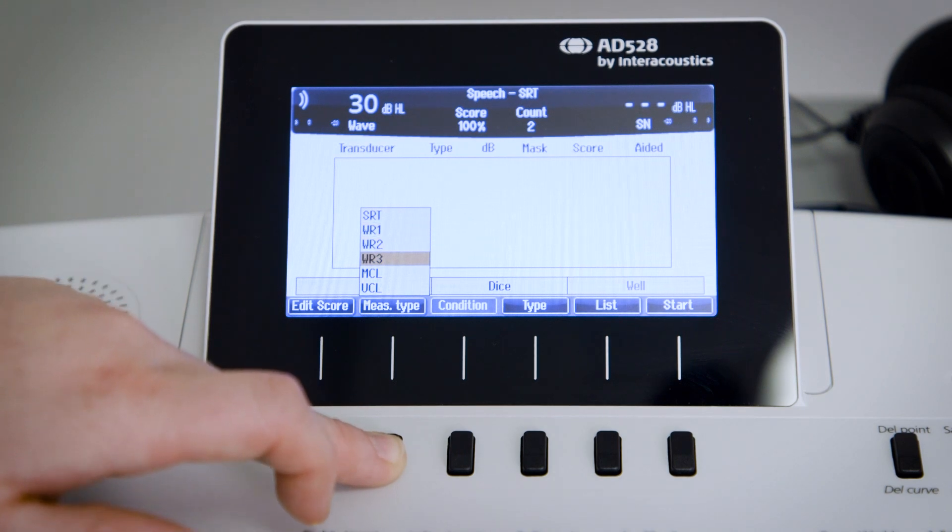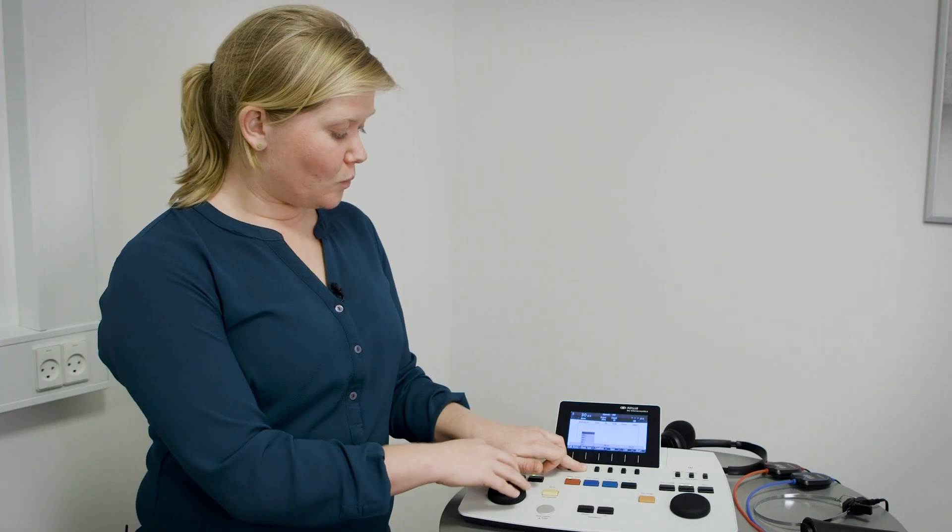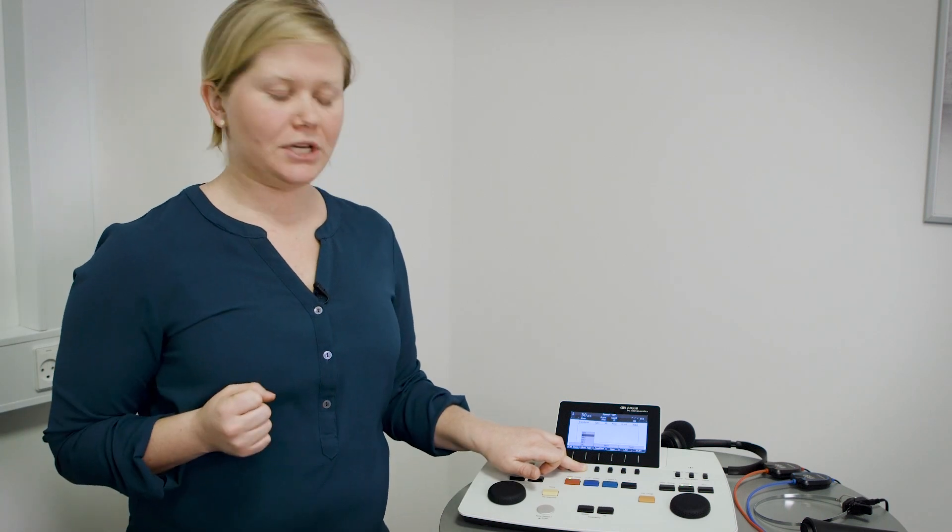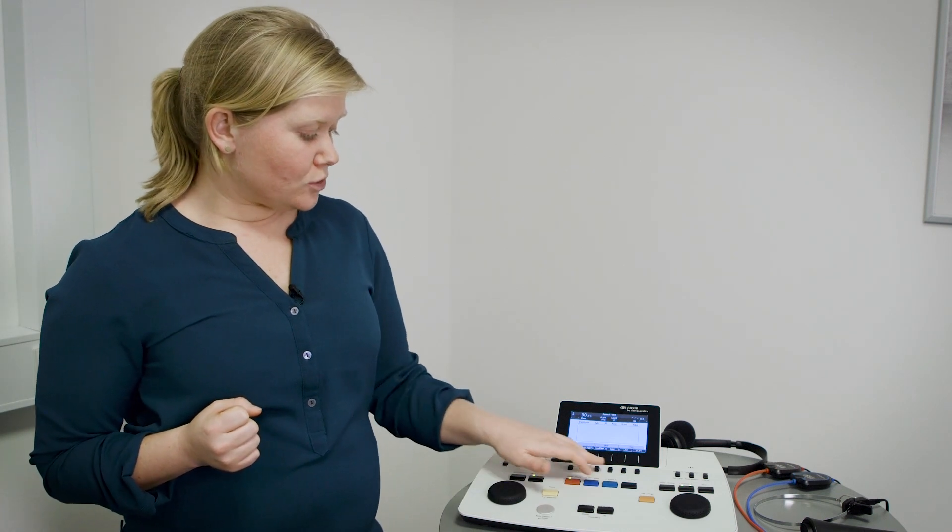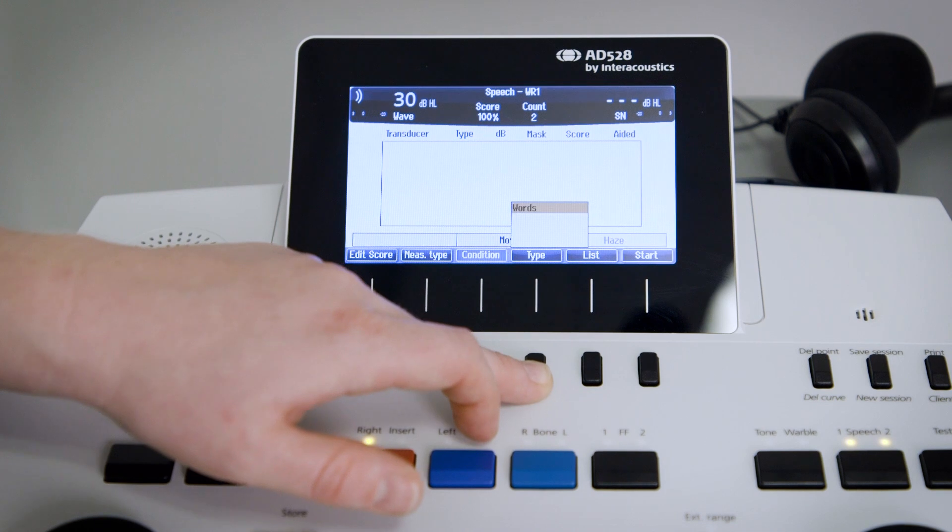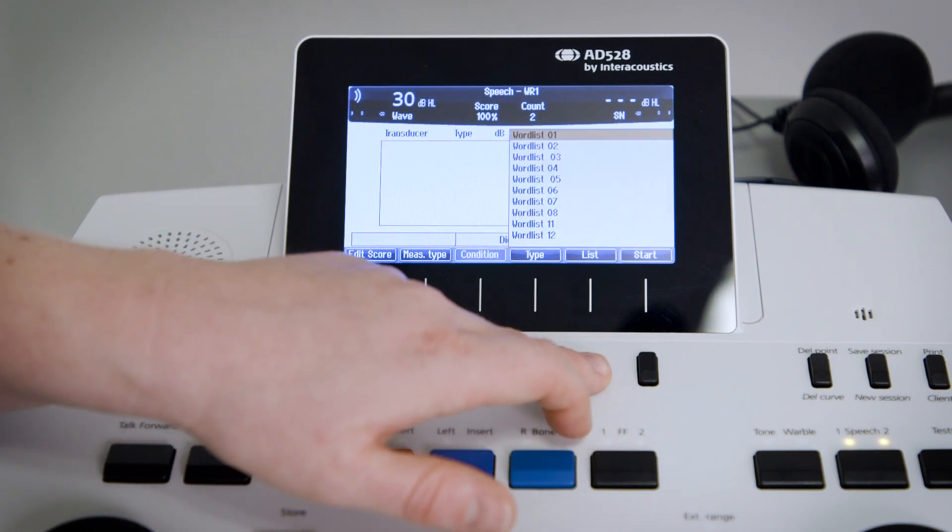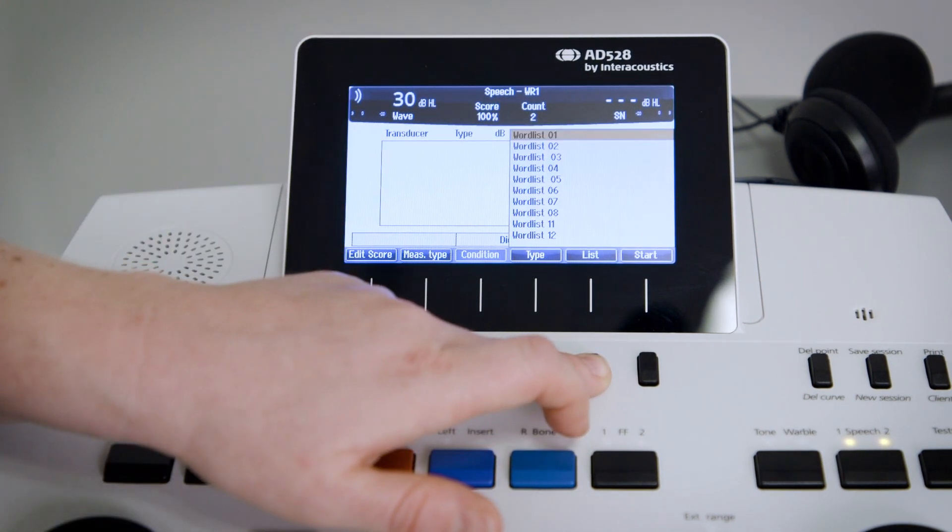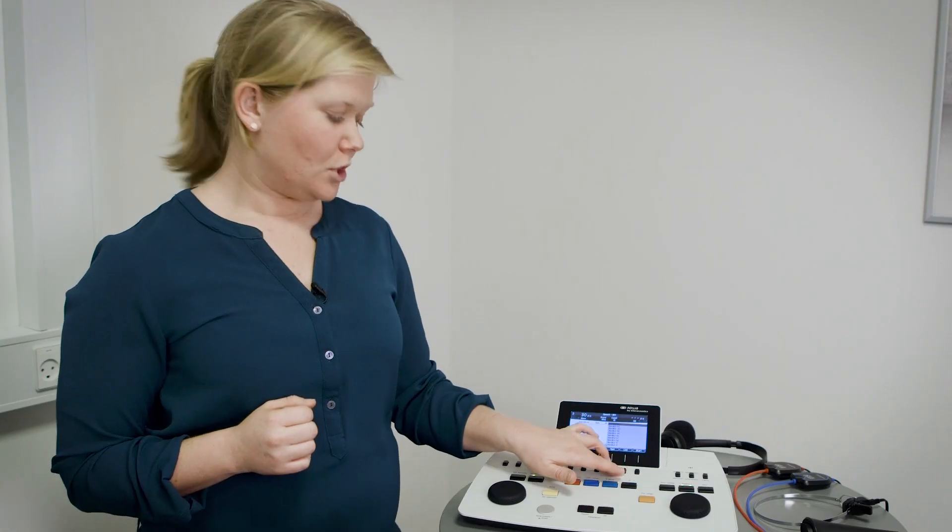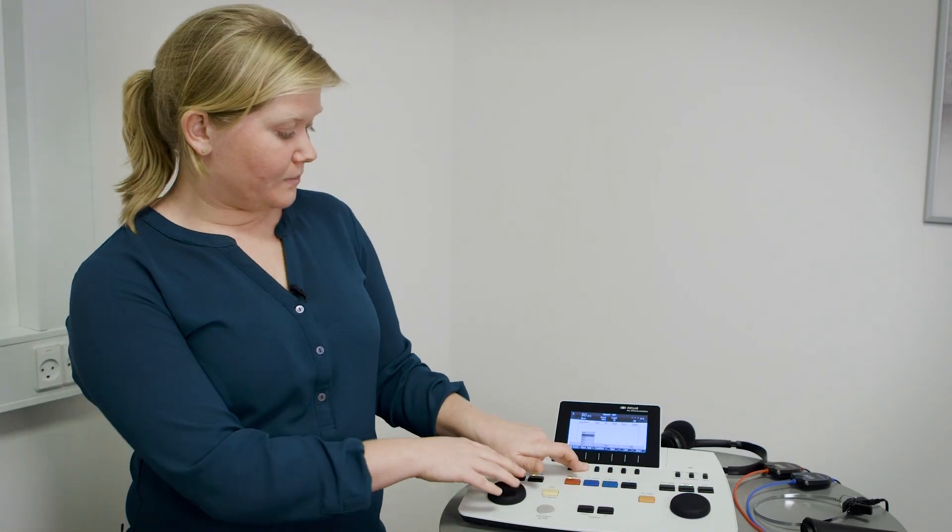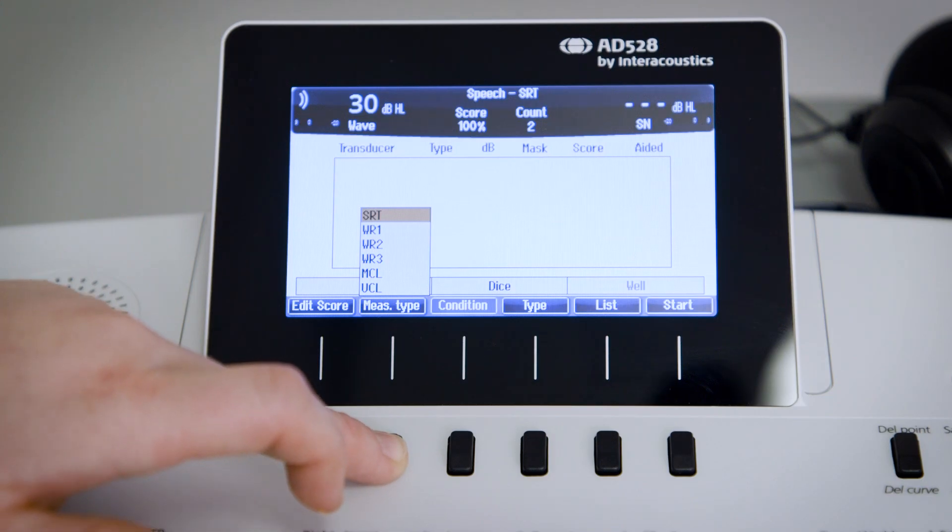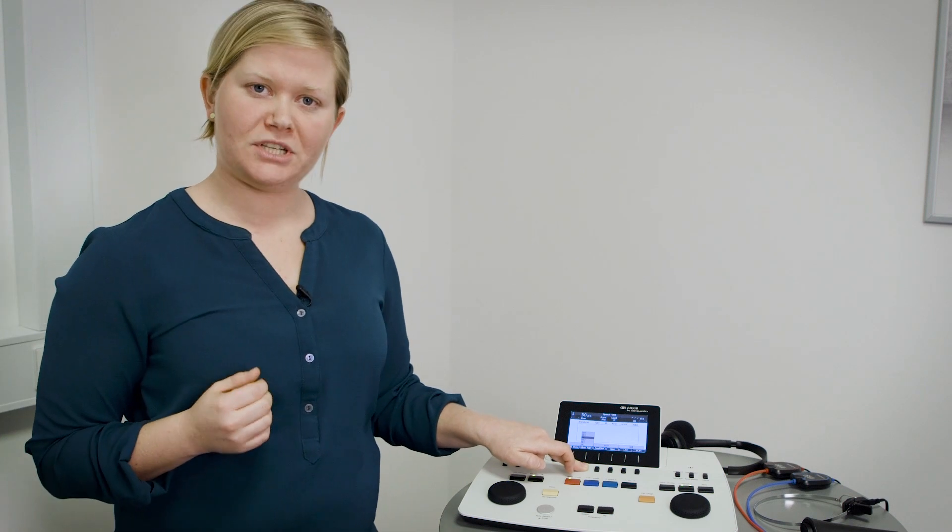The reason we have three different ones is that when you have set the word recognition one, that is linked to a certain type of material, in this matter words, that is then linked to the list that goes with that particular material. So when you change from SRT to VR1 to VR2, it automatically changes the type and the list of material accordingly.